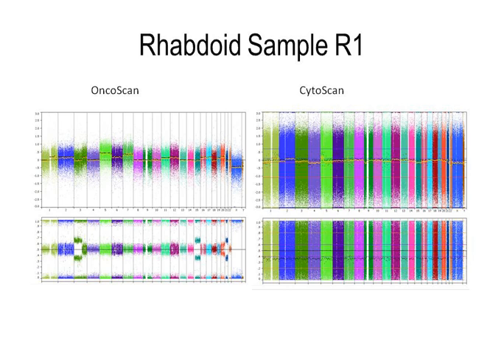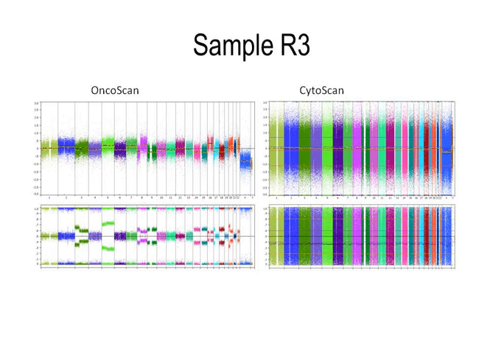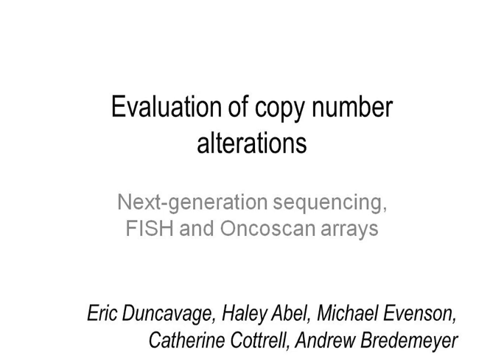But for tumors, we see clearly that these two cases shown here have a very nice delineation of copy number as well as loss of heterozygosity areas, and I show here two separate examples: OncoScan on this side and Cytoscan on this side. So the data analysis is much easier using the OncoScan for FFPE samples.